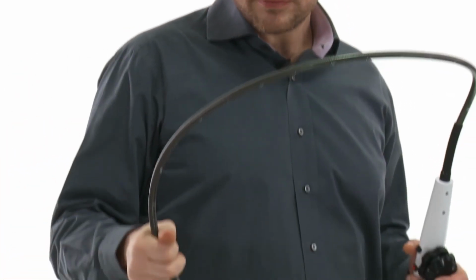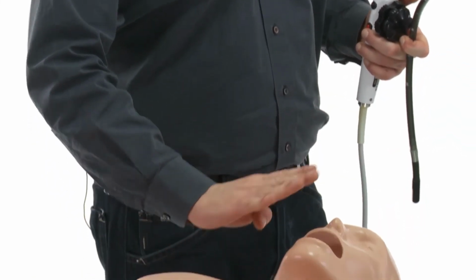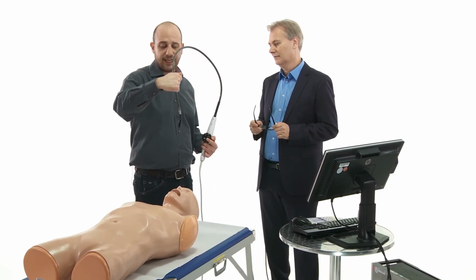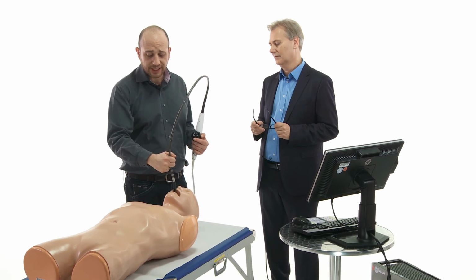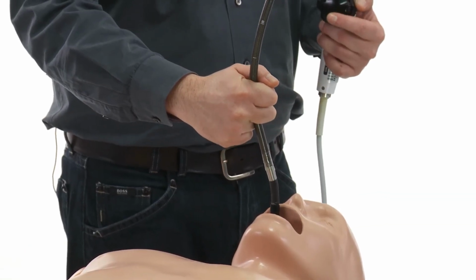That means it's very easy, for the first anatomical curve of our patient, to put the probe in something like anteflexion, something like this. Then I prefer to introduce the probe directly in the middle of the mouth of the patient.